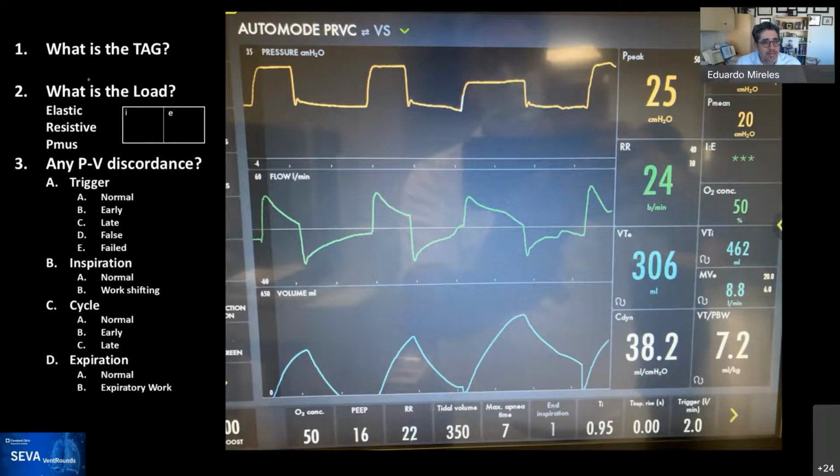So the tag for this mode, you can see actually I'm being cool, I'm putting it here. Thank you, Ryan. You're absolutely right, this is PC. Well, you're not absolutely right. You need to change one letter in your interpretation. This is IMV type 2 AA. And what that means, there you go.